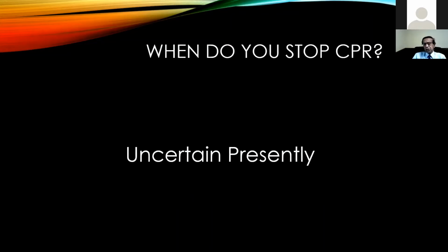Now, when do you stop CPR? Well, in that case, it was 96 minutes. It is still uncertain presently, but capnography during CPR is actually being used as a prognostic value in determining whether patients should be cooled after resuscitation from CPR.